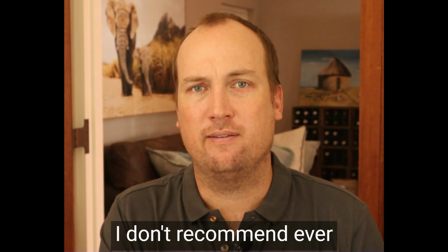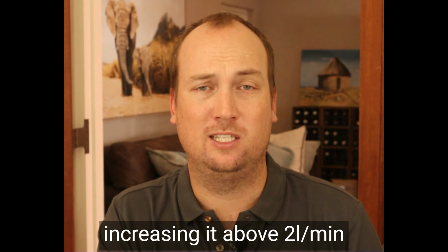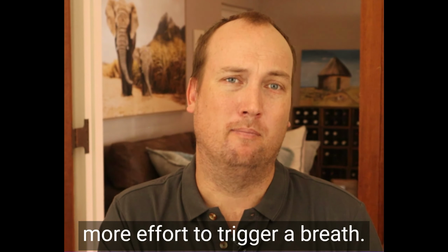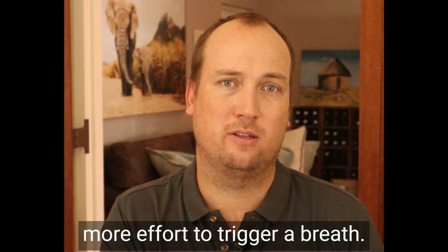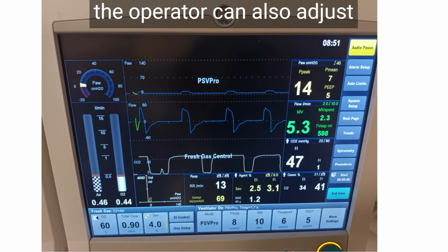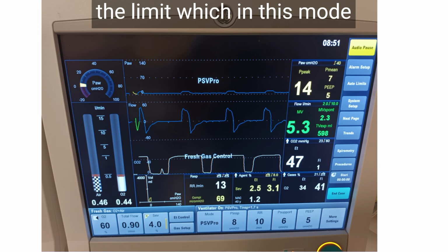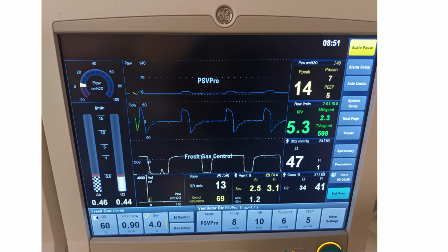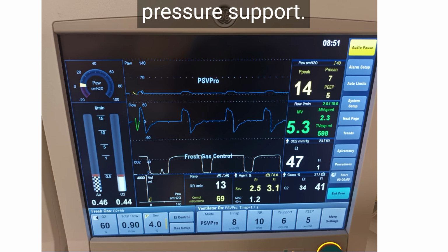I don't recommend ever increasing it above 2 liters per minute though, because that just means the patient has to make more effort to trigger a breath. The operator can also adjust the limit, which in this mode is the pressure support added to each breath. So we can set that pressure support.